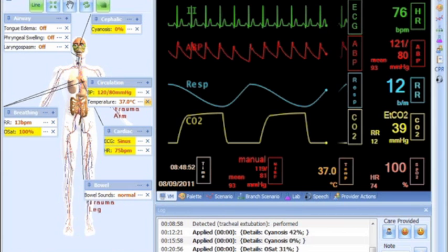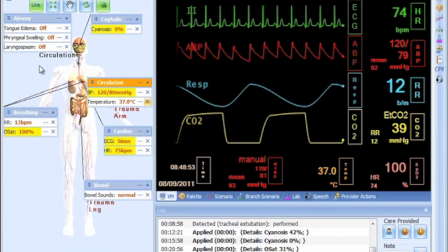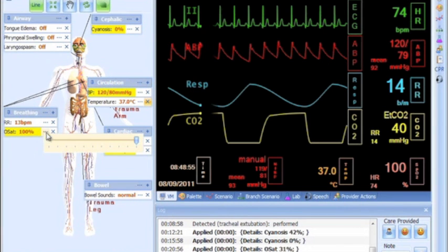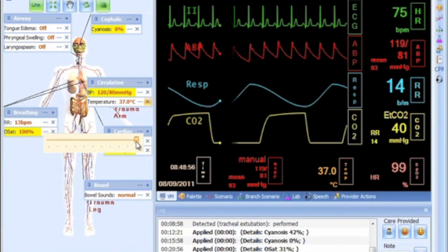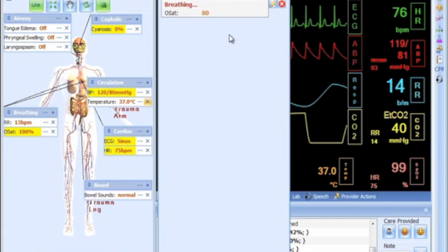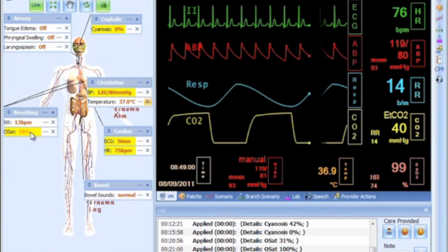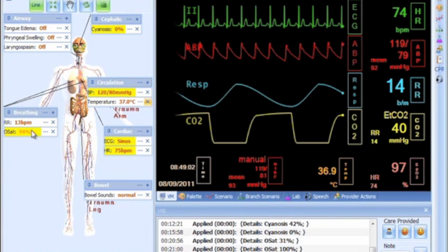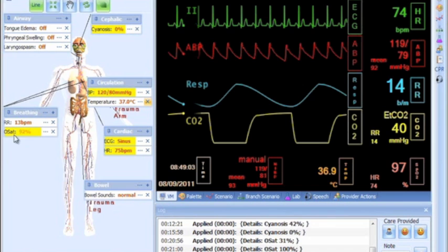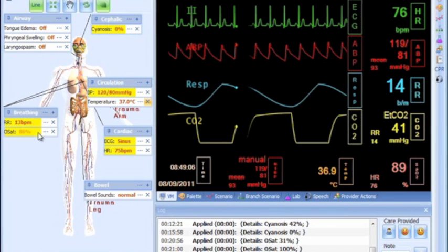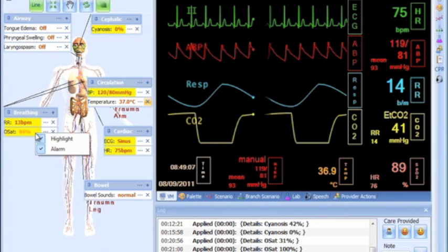Whenever there's a change on a parameter, for instance when a palette gets applied, this parameter will blink to give visual feedback to the instructor. At the same time, each individual parameter can be highlighted, and for some, an alarm can be set by right-clicking over it and enabling this feature.